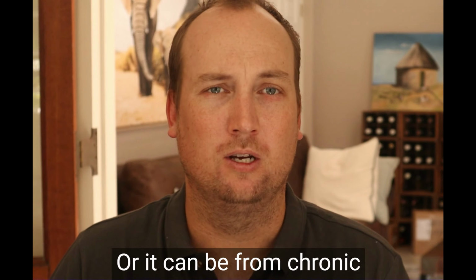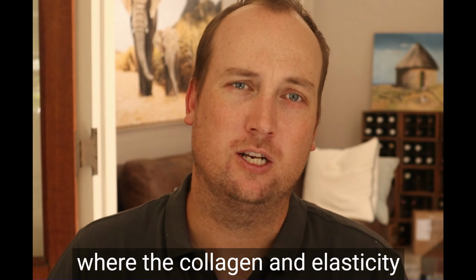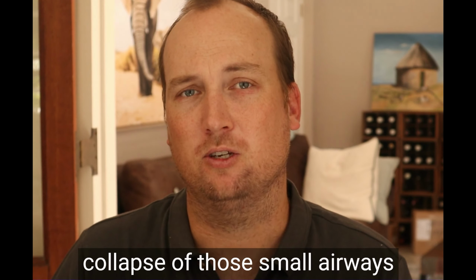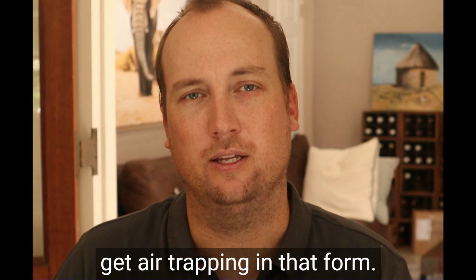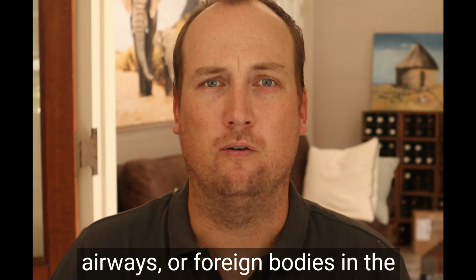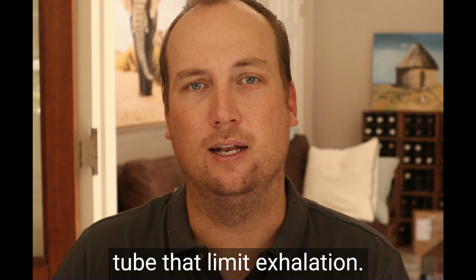Or it can be from chronic obstructive pulmonary disease, where the collagen and elasticity of the small airways are damaged, and so there is early collapse of those small airways during exhalation, and so we get air trapping in that form. There can also be other airway issues, such as secretions in the airways, or foreign bodies in the airways, or a kinked endotracheal tube that limit exhalation.